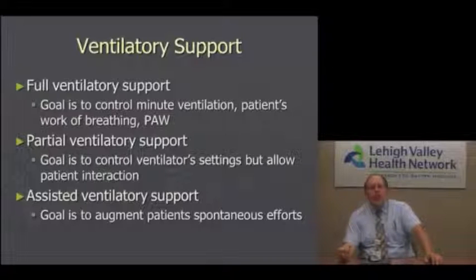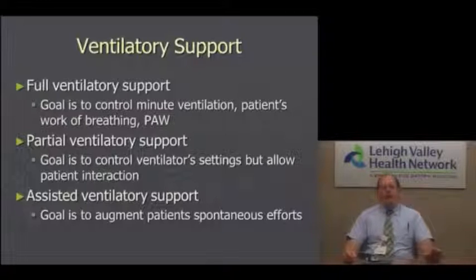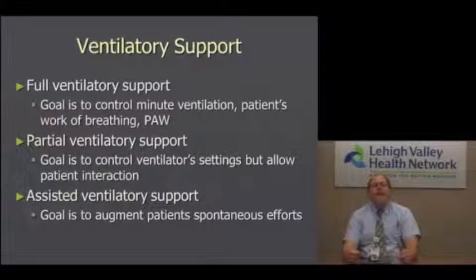Full ventilatory support is really what I think a lot of your group is going to be doing. It's really controlling the full minute ventilation of the patient, the work of breathing, and the mean airway pressure. In this mode, you really don't want a lot of patient interaction with the ventilator. You really want the ventilator to do the majority of the work for the patient and the majority of gas exchange. It's not saying that some patients can't interact with the ventilator, but the majority of the ventilation should occur from the ventilator and not the patient.